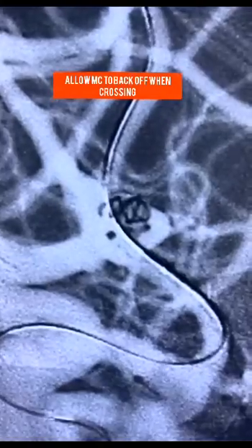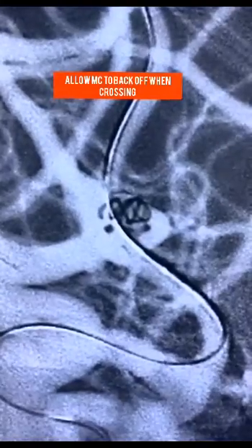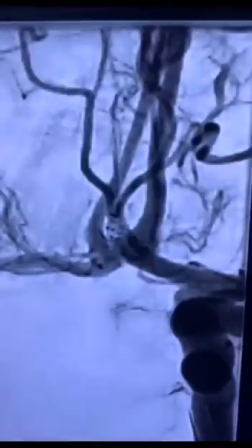When the last loop of the coil is being pushed, it is better to allow the microcatheter to fall back to avoid injury to the aneurysm wall.